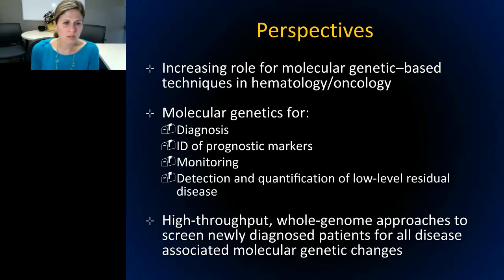The next question is, what is the best way to identify the fusion transcripts in a tumor sample? Well, that's a good question. Essentially, it comes down to what exactly it is that you're looking for. It's common practice for particular genes to be detected in particular ways.